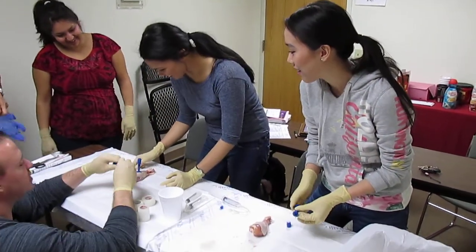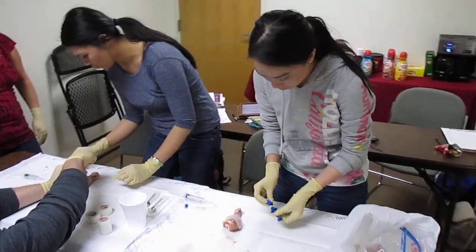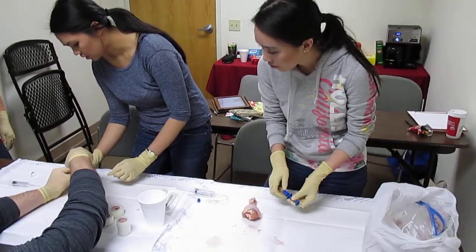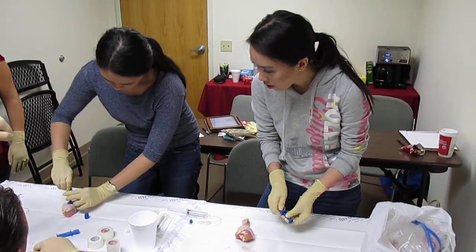The other thing that happens, because all these things spin, make sure you hold here to take your cap off. Pull it straight up.